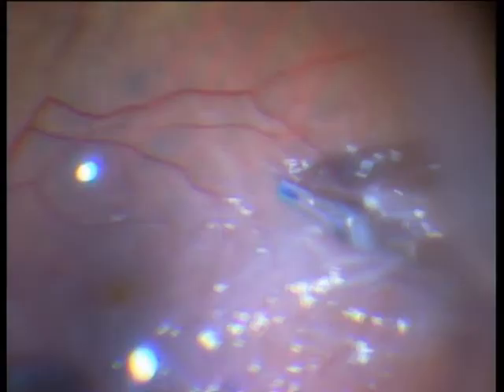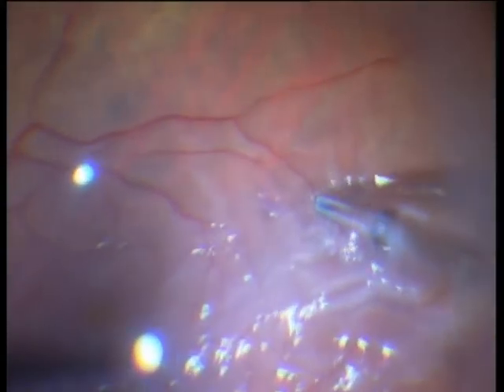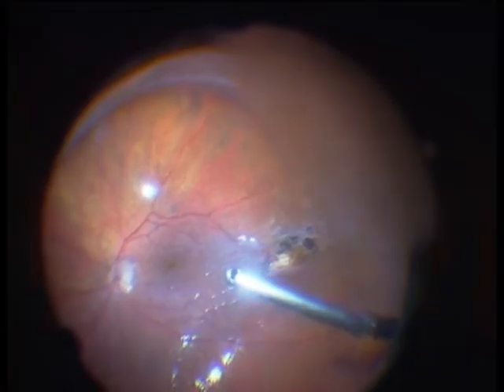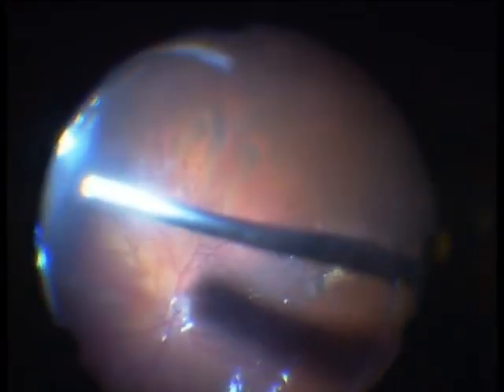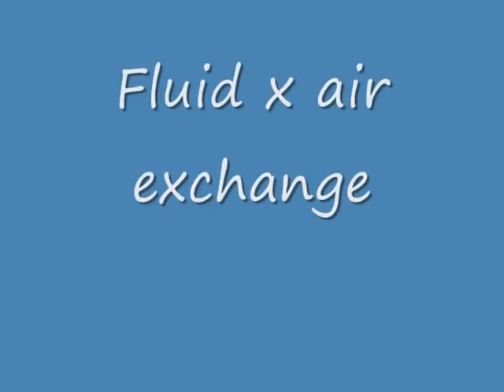The membrane is overall very, very adherent and we have to go to the arcades. Here you see the rupture, which is very central. The detachment was only one week old, but I think that the problems were going on for a much longer time.